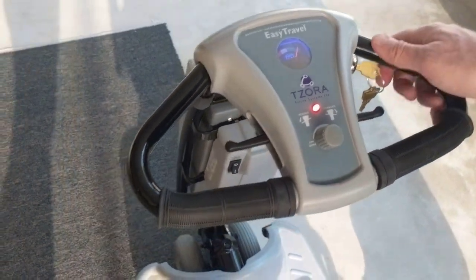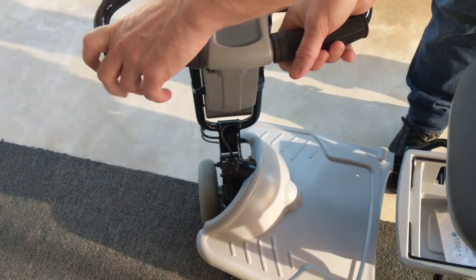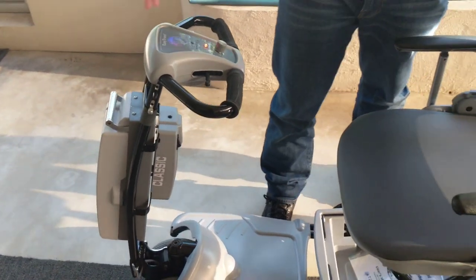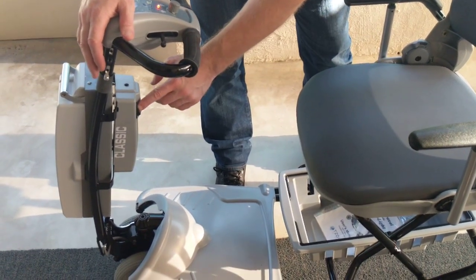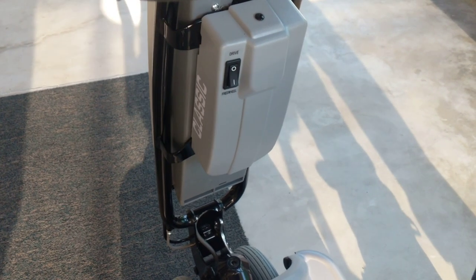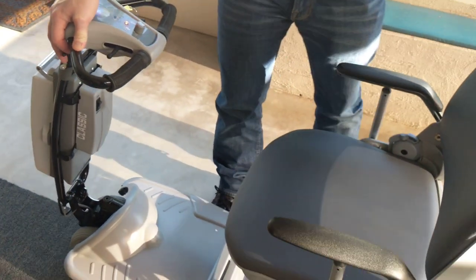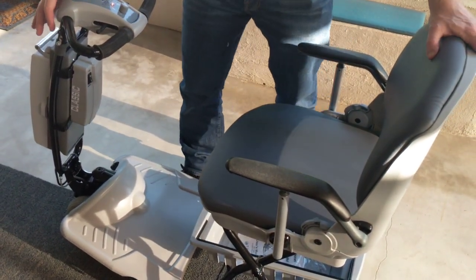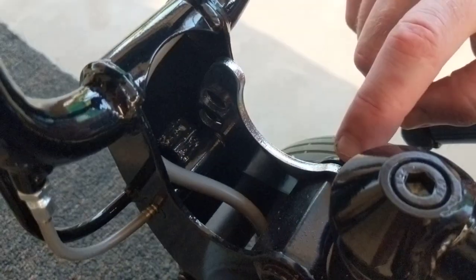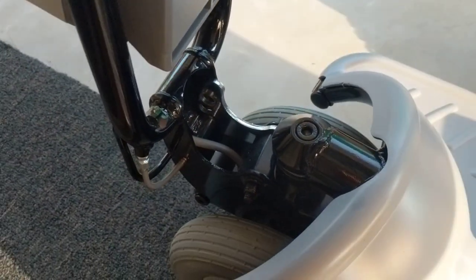Looking down at the floor at the steering range, the steering column has a pretty impressive turning radius and turning ability, giving a lot of control while driving. Two more features before we fold the Lexus Light: when the battery is engaged, you can switch between drive and freewheel. Drive locks the scooter and allows it to function as a power scooter, while freewheel allows you to push the scooter back and forth by hand. At the bottom of the tiller, there's a locking mechanism and a sprocket with several perforations that allows for different control settings.